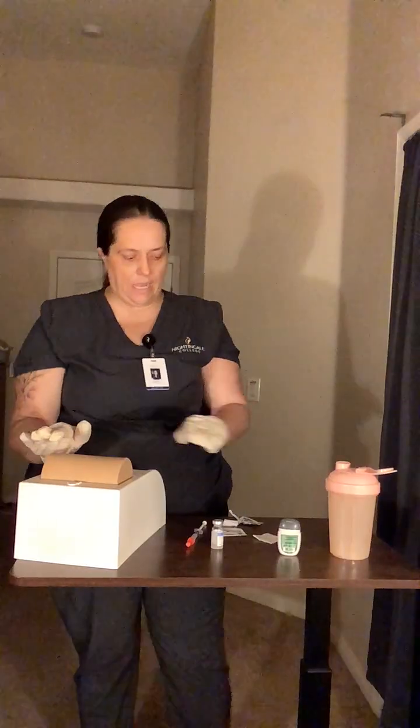Go ahead and do the one-handed scoop method to get the cap back on. I'm going to push it down. At this time, I'm going to check the abdomen for redness, swelling, inflammation, any kind of bruising, or any kind of wounds. I don't see any of that, so I'm going to go ahead and palpate it, see if there's any tenderness or pain, because if so, we need to pick a different site.